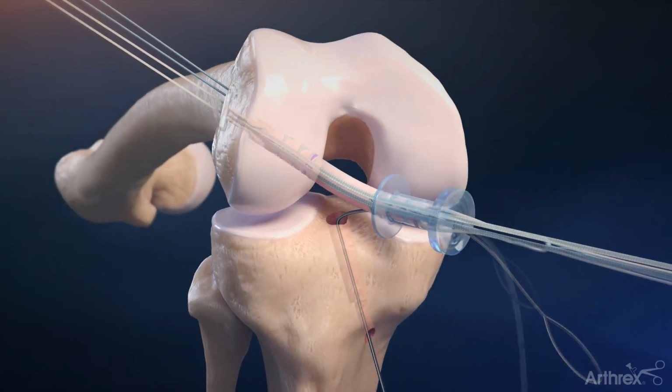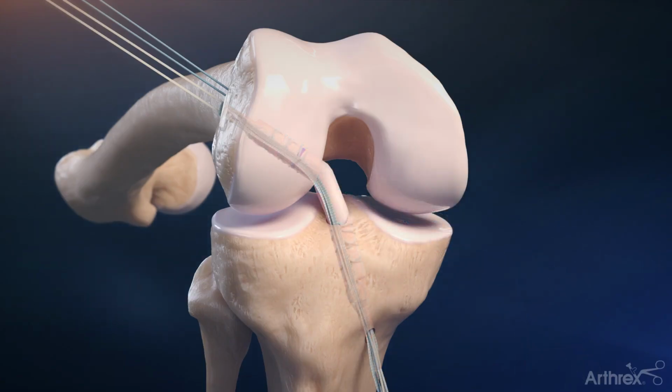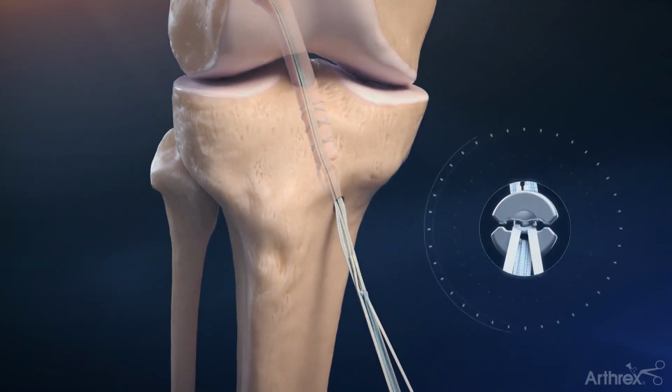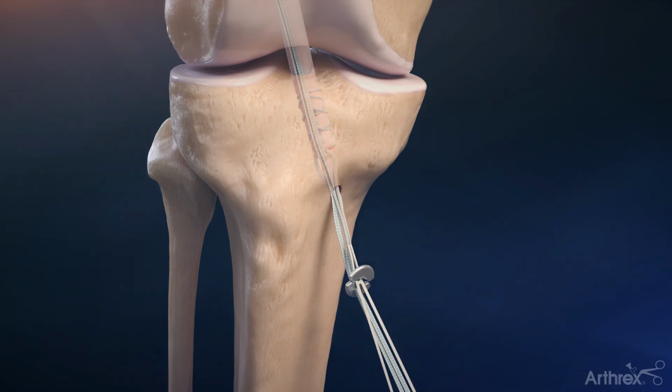With the black and white fiber snare suture, pass the fiber tape suture for the InternalBrace technique and the ABS TightRope II implant into the tibia. With the knee in extension, use an 11 mm 3-hole concave button for tibial fixation of the QuadLink construct, with the fiber tape sutures for the InternalBrace technique loaded through the larger oblong hole.